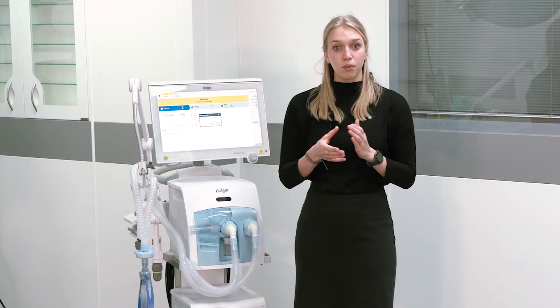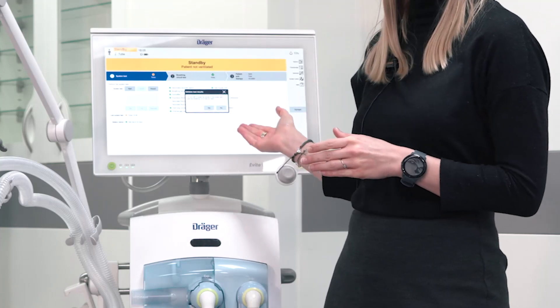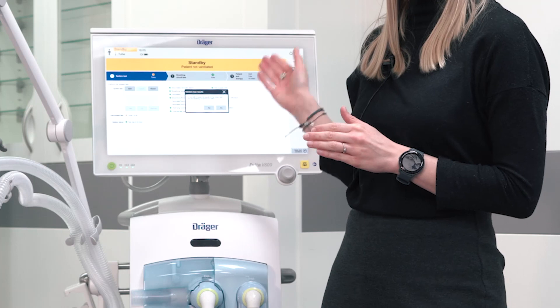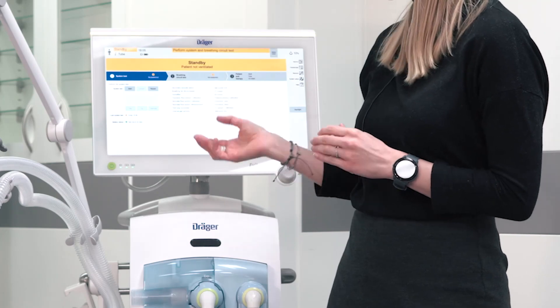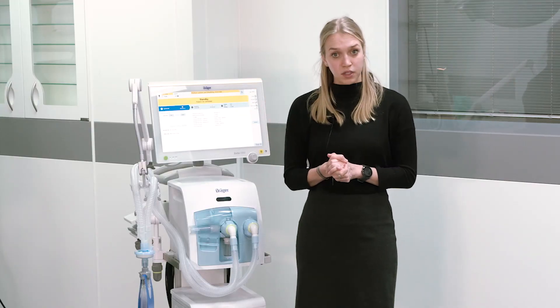Due to different hospital requirements, the ventilator will ask you whether the system check and the breathing circuit check have been performed already. If you acknowledge that message with yes, you will be directly guided to patient admission. If you have not performed it, please press no and you will be guided to the system check.